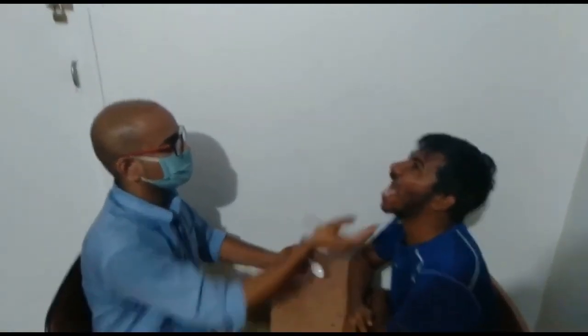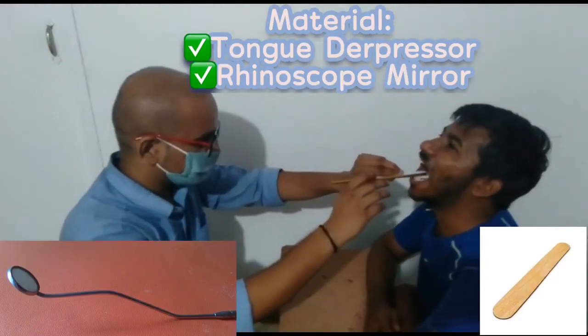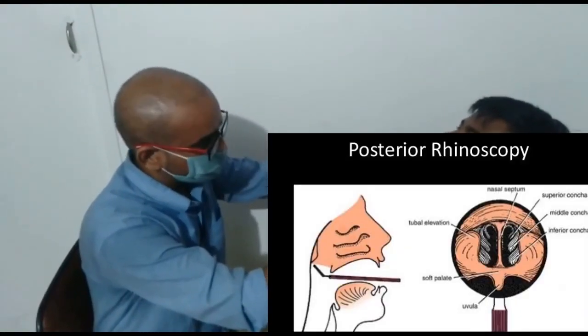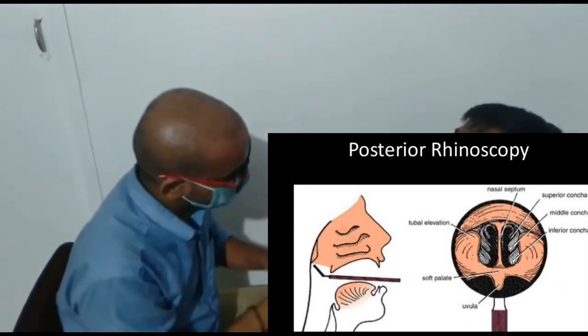Can you just open your mouth and put your head up, chin up? This is the tongue depressor, which is used to depress the tongue. And this is the mirror, with which we are going to see whether there are any adenoids, larynx and nasopharynx. Okay, thank you. And this is the procedure of posterior rhinoscopy.